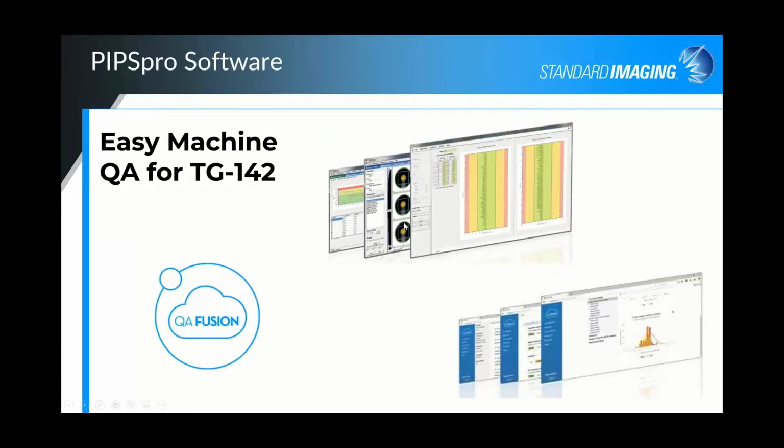So basically, our PIPSpro software is easy, automated machine QA for TG-142. We also offer it in combination with our QA Pilot software, which we call the combination QA Fusion. And that Fusion is actually the test component within PIPSpro, as well as the QA management component of our QA Pilot software, and I'll touch on that a little further down the presentation.